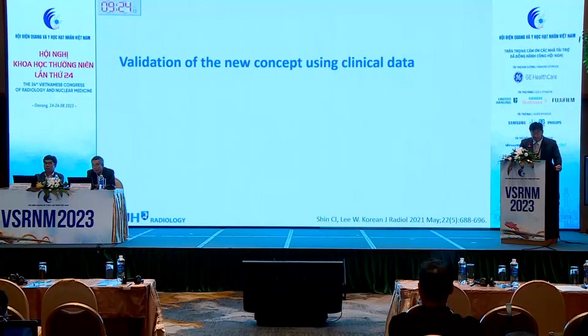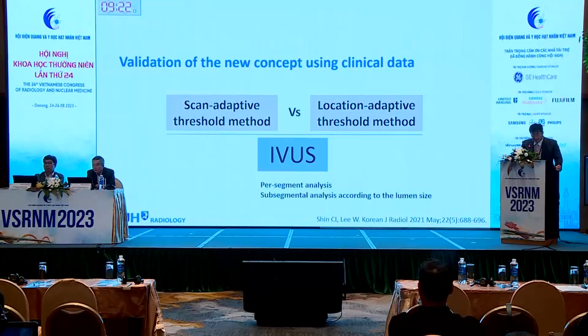So, validation of a new concept using clinical data. We need a gold standard. IVUS is the gold standard. So we selected patients who underwent IVUS and measured plaque volume. We can measure the plaque volume by the location adaptive threshold and also by the scan adaptive threshold method.